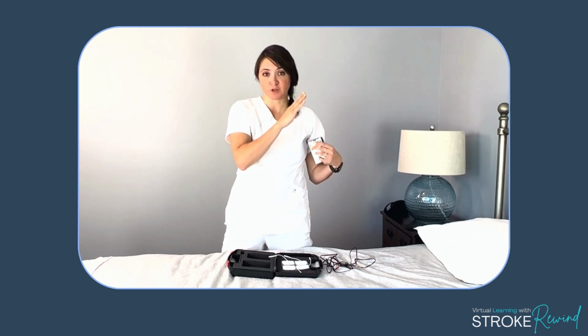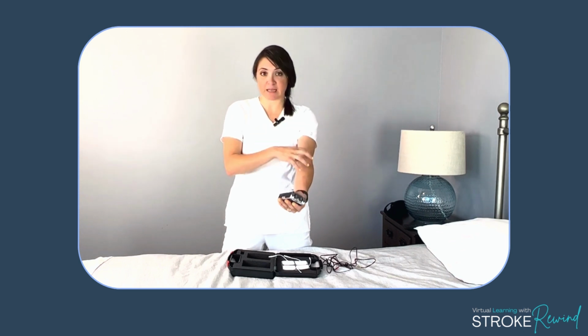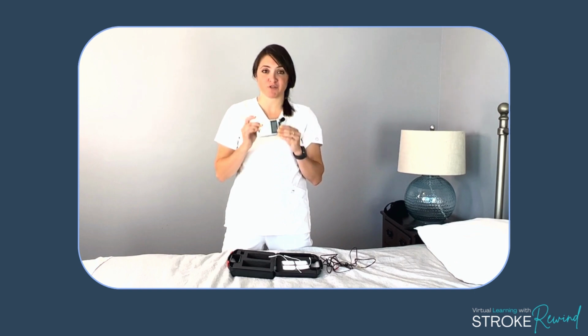Talk to your doctor before doing this. The precautions are just things to think about before doing this. Although it's not an absolute no, you shouldn't use the TENS unit, it's definitely something you still want to bring up with your doctor. For example, if you have cancer, but maybe it's not in the arm or the area of skin that you're doing, it's somewhere else in the body, you want to call your primary care physician and say, hey, can I use this on my arm? So please, please, please make sure you take a look at that list and talk to your doctor before doing this.